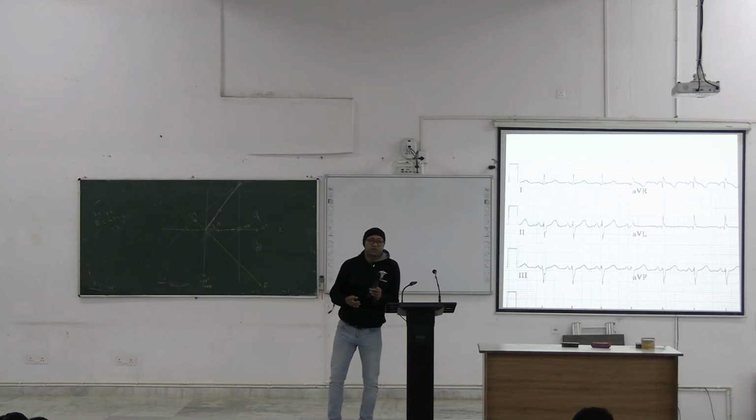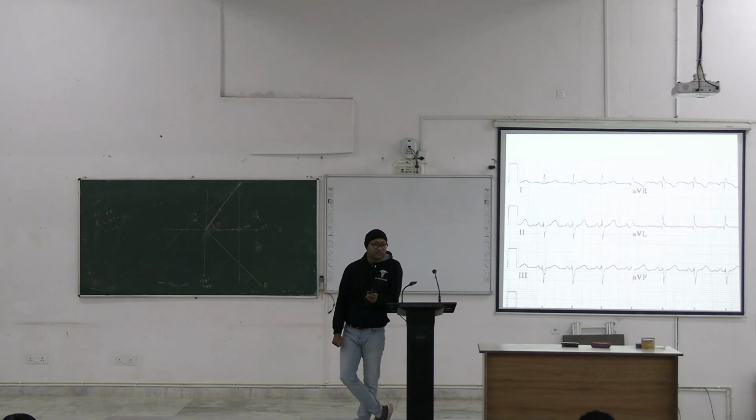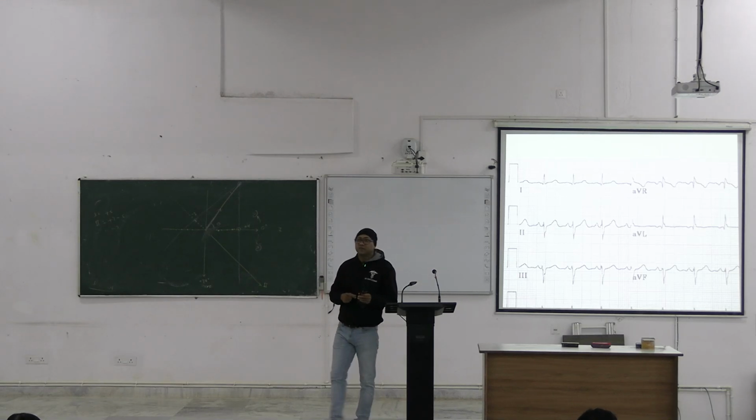In our clinic, when we see patients and interpret an ECG, we always use the thumb rule, because the exact degree is not actually required in clinical practice, right? But you need to have an idea.